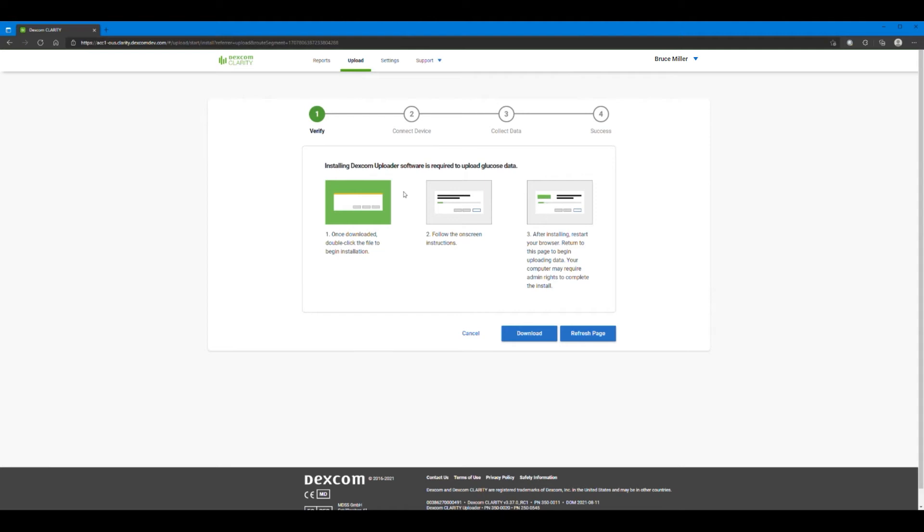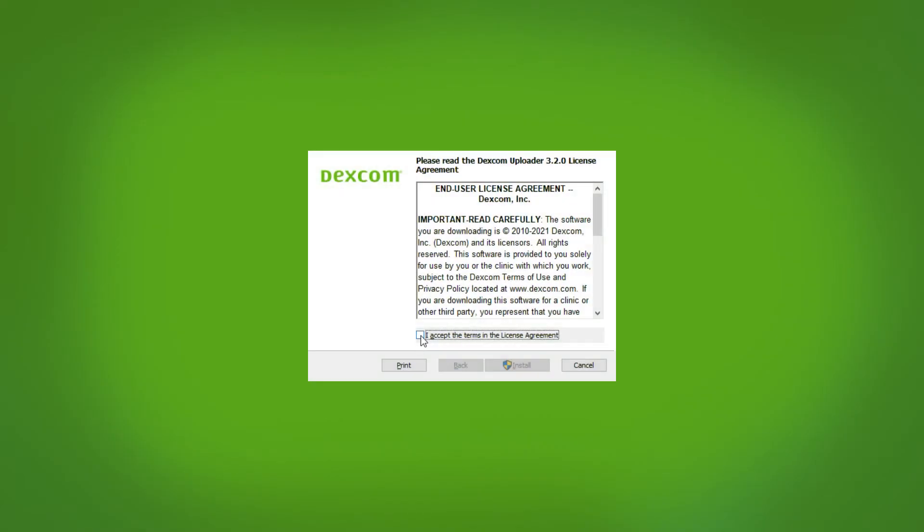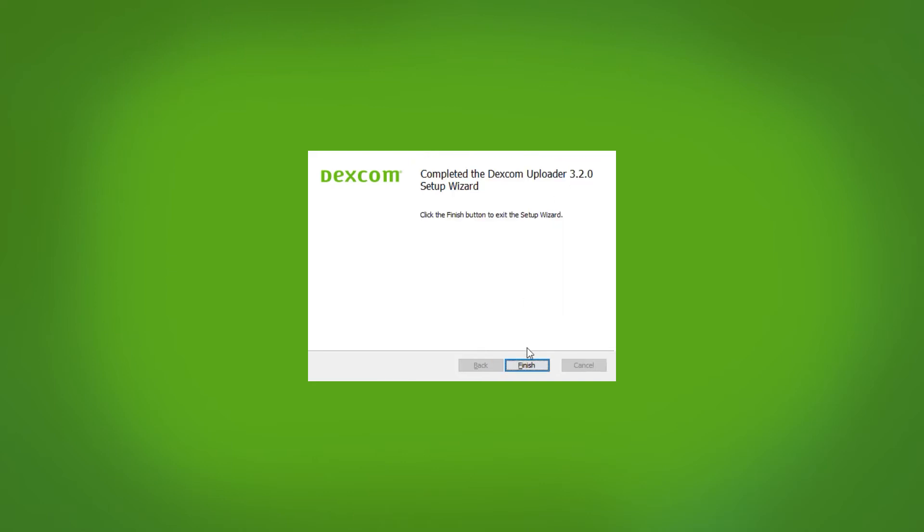For the first time, you'll need to install the Dexcom Uploader software. Click Download to begin. Open the file and follow the instructions to install the uploader onto your computer. When it asks if you want to continue and install, click through the prompts.